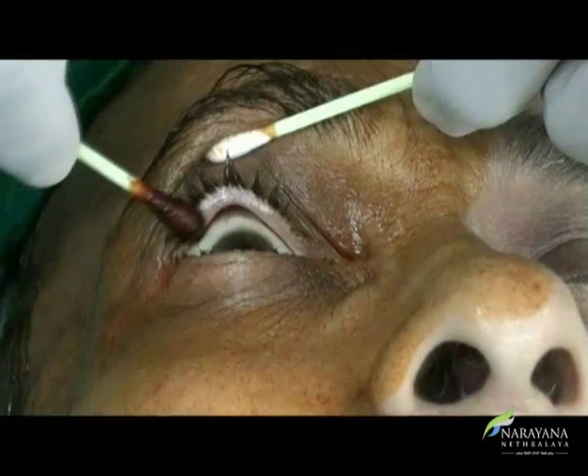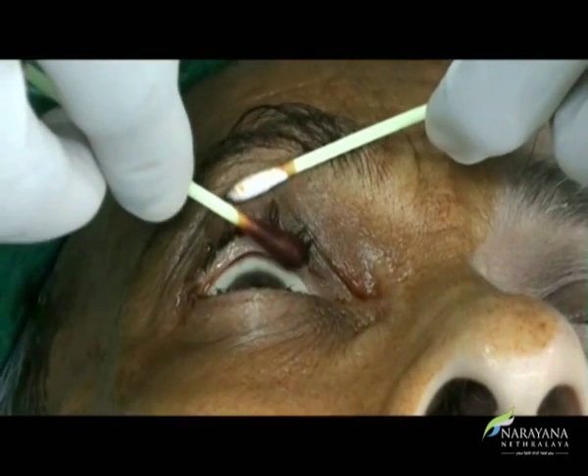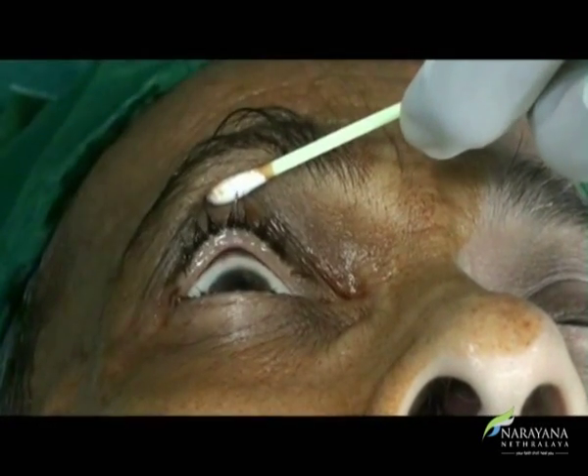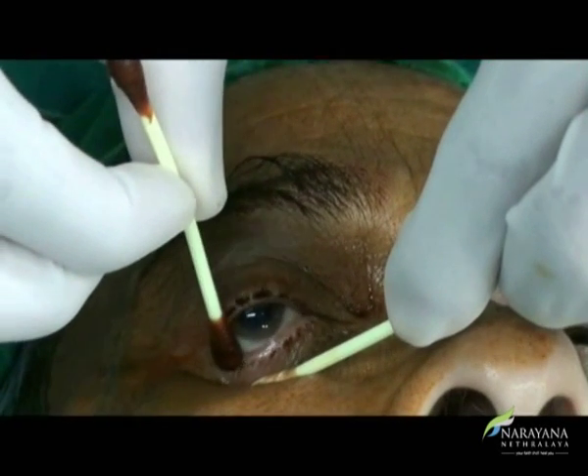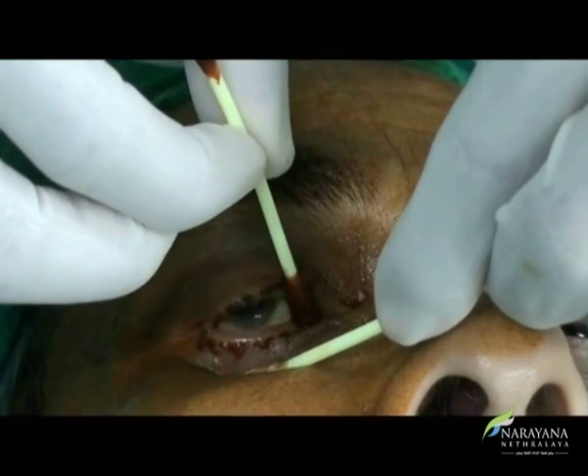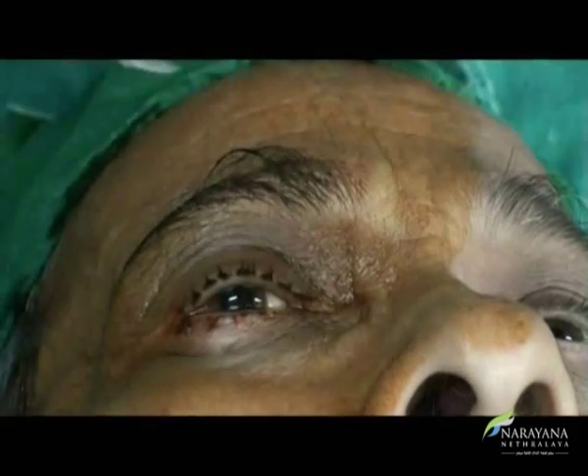No-touch technique is of utmost importance, especially for eyelashes. These are cleaned with each side of a cotton-tip applicator dipped in 5% povidone-iodine, starting from the lateral to the medial side as shown.